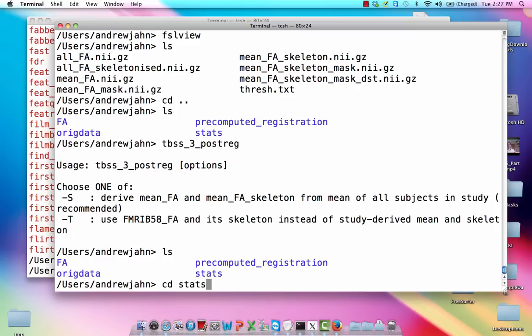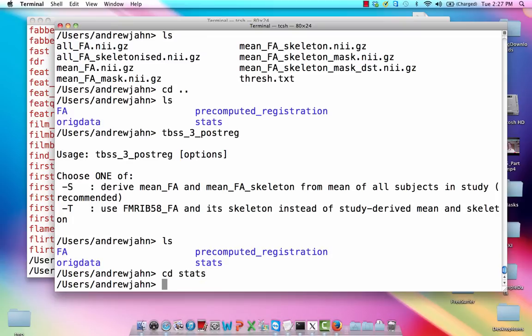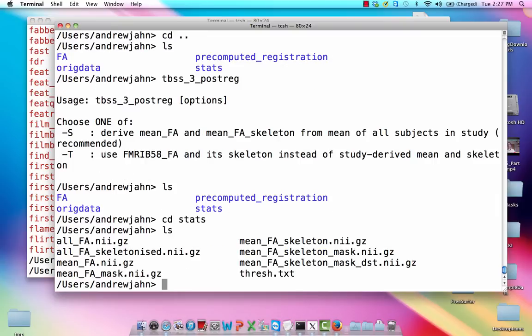So now we're starting to fill in things like what is the mean FA skeleton. And it's also going to merge all of our different FA maps so that we can compare each of them against this skeleton that we've just created.